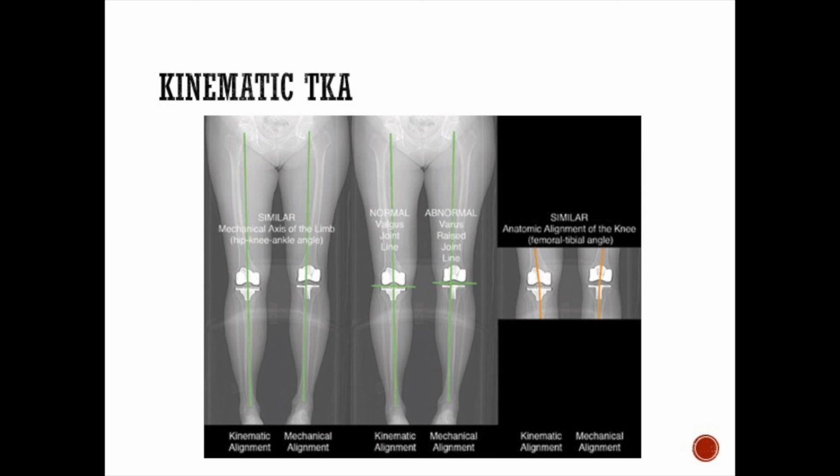Additionally, we talk about physiologic varus when we put in an implant based on the measured resection technique, where it usually does end up in slight varus, which is sort of where the knee lives. However, with a kinematic knee, you can obviate that and, again, more accurately reproduce a flat, stable platform to bear weight on without any translational or shearing forces, which in theory may increase the longevity of the implant. Again, this has not been borne out in the literature.